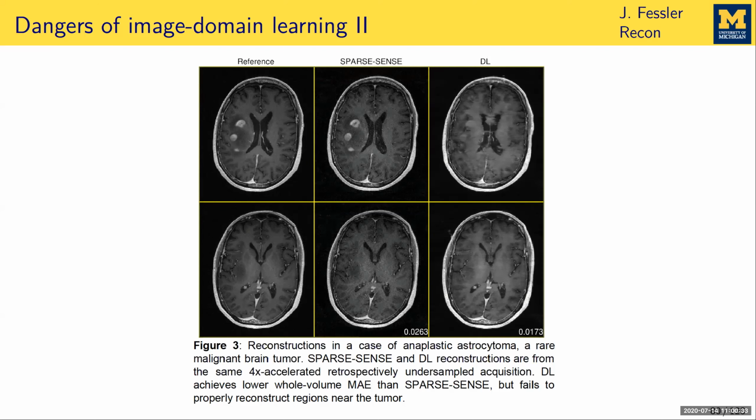Well, I'm also curious about what the analytic reconstruction would look like. Oh, that would be interesting to see. Full acceleration. Yeah, I agree. Obviously, not as good as this. Right, because that analytical reconstruction, of course, was the input to this method. Exactly. And you can kind of still see where the tumors would be in the DL reconstruction, but it just kind of blurred them out.